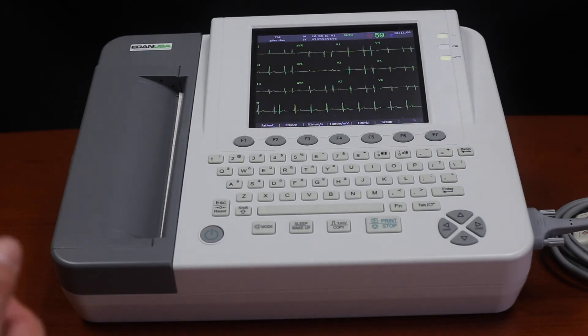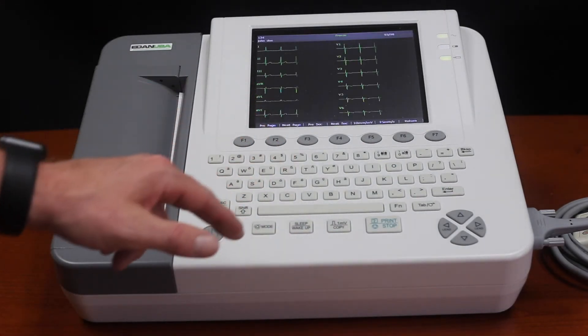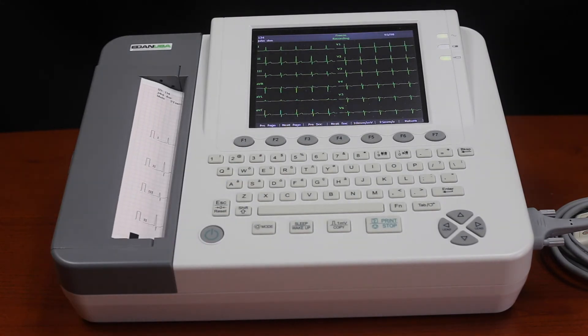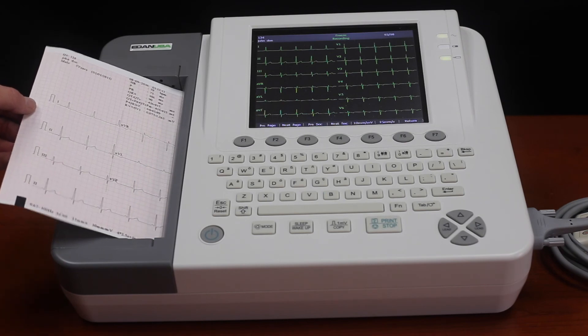To give you a quick idea of how to print — it's really easy. We just freeze the screen and press the print button. It's as simple as that.